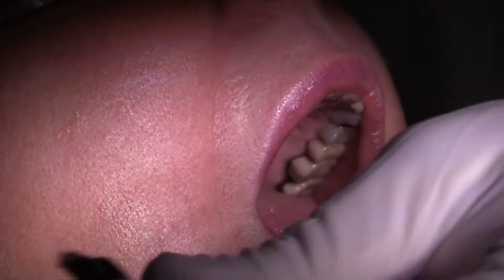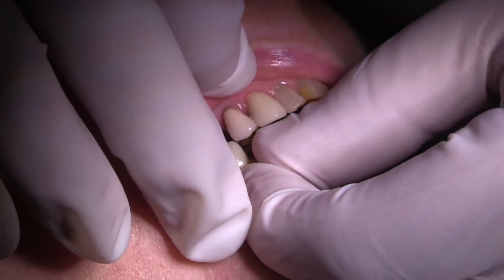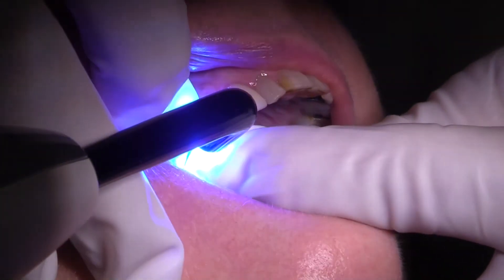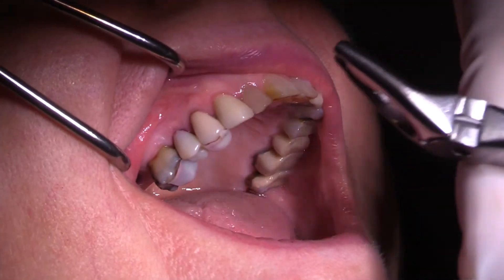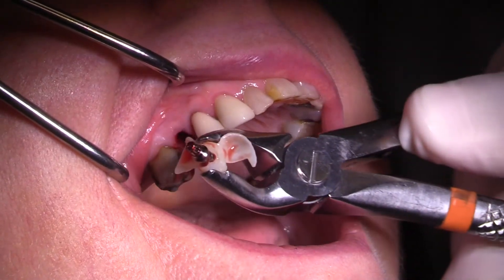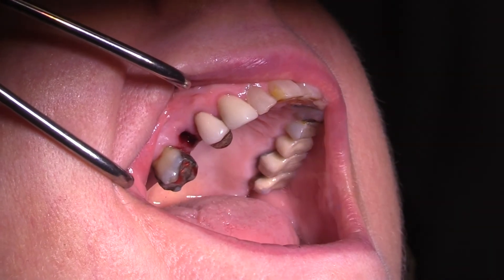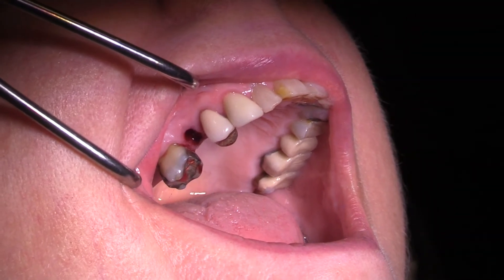We just want to pick up that cylinder as we place the temshell back into position. Using the two adjacent teeth, this will line up the temshell over the cylinder, which is fully seated on the implant without a screw. Once this sets, we tug the whole assembly off — since there's no screw, it comes off together — and then we'll add flowable to fill in any voids we couldn't pick up during the procedure.